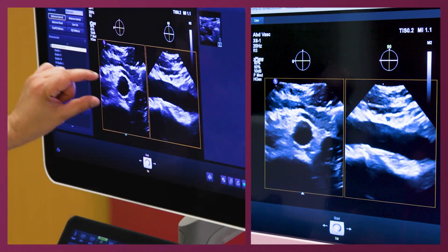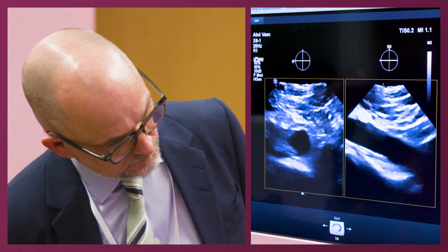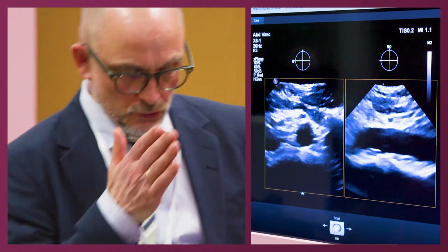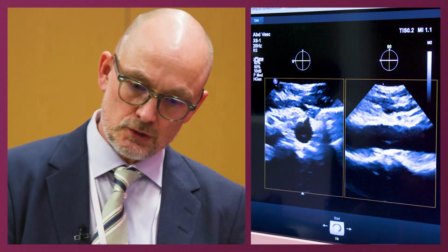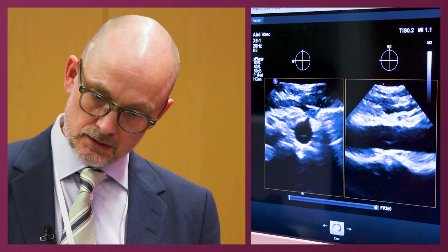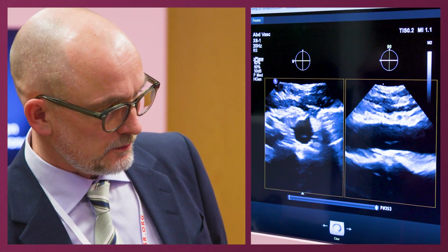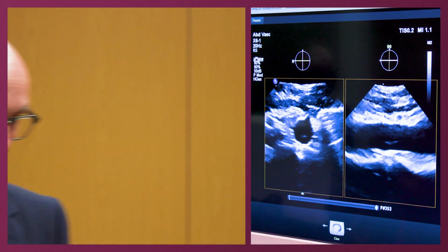You want to see the vessel? It has to be like this. Exactly. So now you're sure that you make a perpendicular slice of the sausage here. Again, I choose. Okay, that's even easier to find. And systole, you can see on a healthy aorta, it actually means a lot. Systole and diastole, it does affect it.